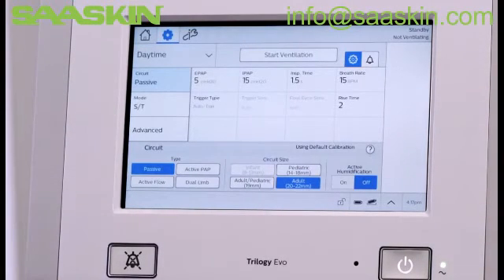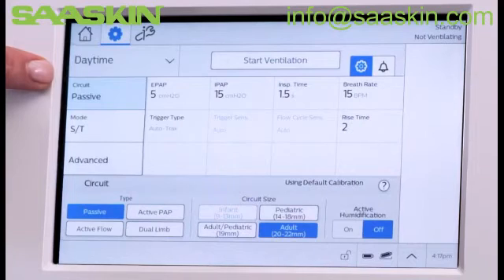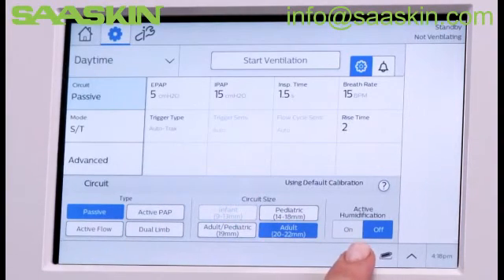In the Settings window, you can view and edit all the prescription and alarm settings. Circuit is highlighted in blue and setting options appear at the bottom of the window. Verify the circuit type, size, and humidification settings.